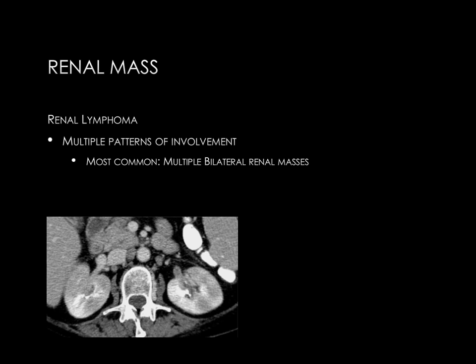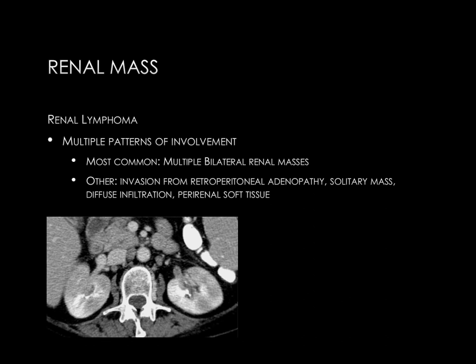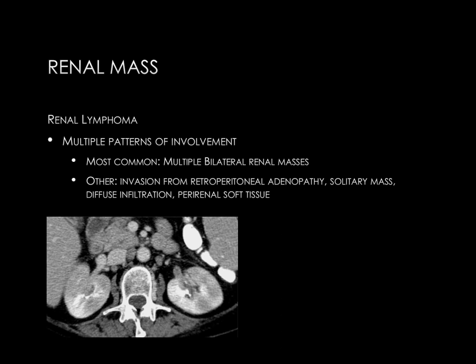Finally, we'll discuss the appearances of renal lymphoma. There are multiple patterns of renal lymphoma involvement. The most common is multiple bilateral renal masses. The CT image demonstrates multiple rounded areas of hypo-enhancement in the renal cortex compatible with multiple bilateral masses. Additional patterns include invasion from retroperitoneal lymphadenopathy, a solitary renal mass, diffuse infiltration, or perirenal soft tissue. Another CT image demonstrates ill-defined retroperitoneal lymphadenopathy compressing the IVC, with lymphadenopathy growing into the right kidney as indicated by the yellow arrowheads.